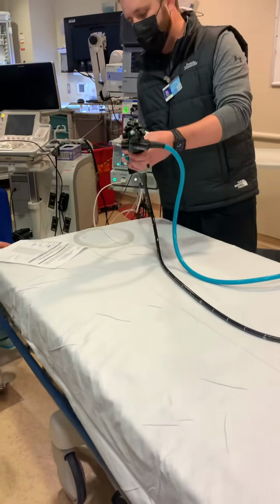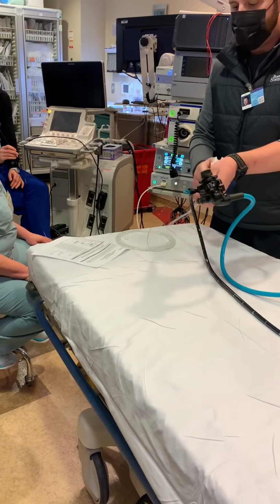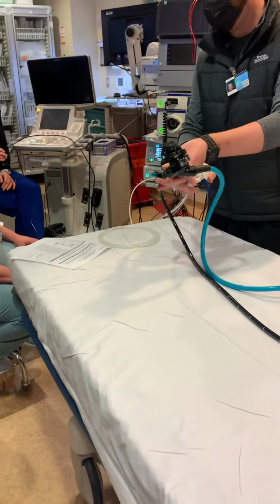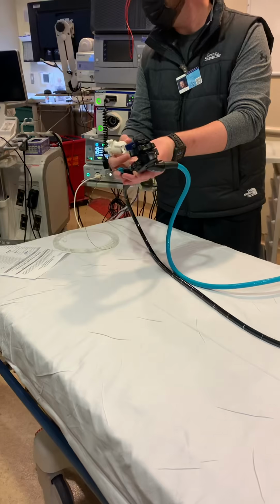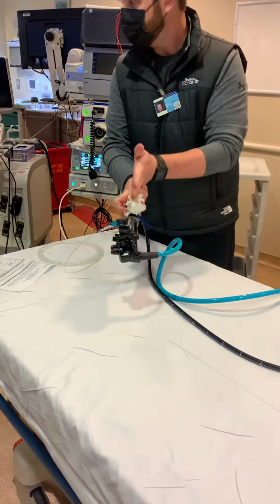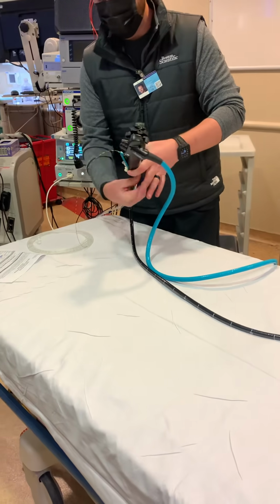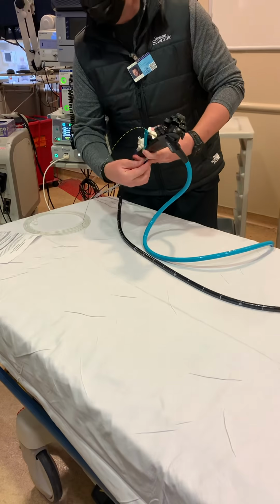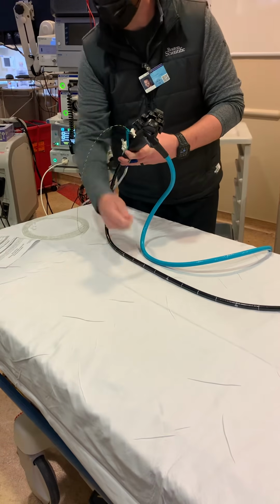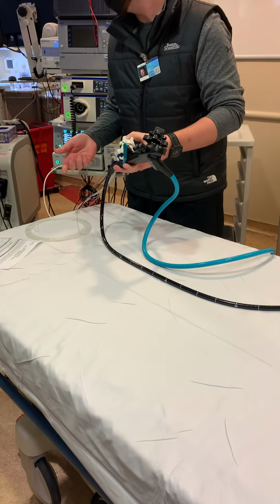The handle has a little nook right here. We want to put that on the hard plastic part of the duodenoscope, not the rubber part. So you just find your rubber wrap for your locking device, just go right below it. Make sure the dials are in line with one another. And then, like with all these devices, the easiest thing to do when you're wrapping anything around the handle of the scope is not to just immediately try to wrap it around, but pull it away from the scope, and then bring it around. It gives you a whole bunch of extra slack to use, and it's super easy to put it on.